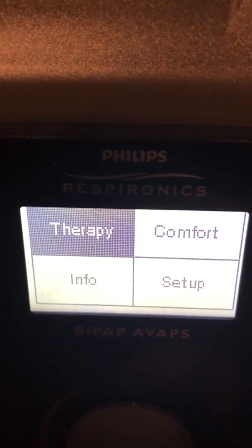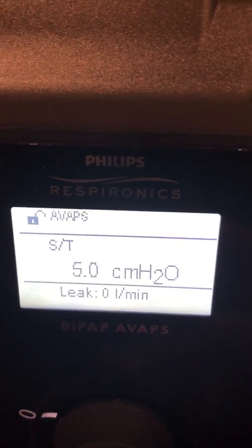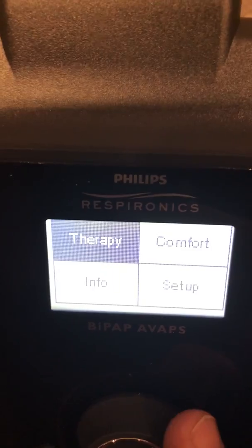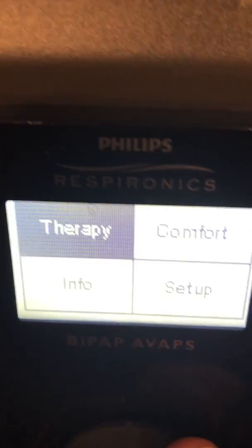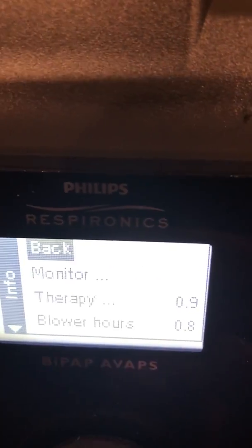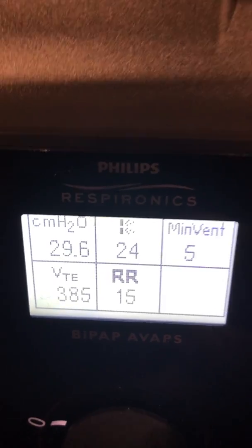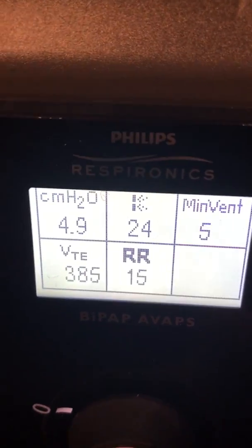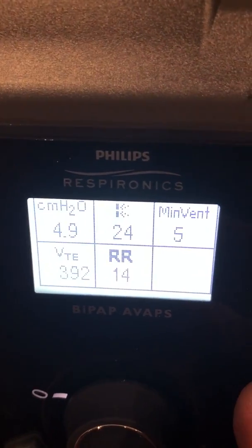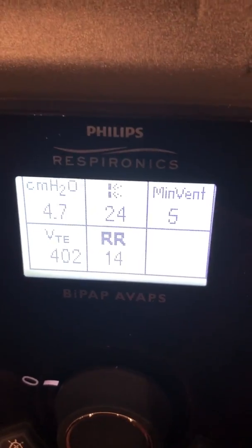Here we are at therapy — I'll select therapy, and at this point the machine will turn on. I'm going to hit the button one more time to get another option. For all of us clinical people who want to monitor certain parameters, I'm going to go down to info, select, and select monitor. Now we've got our airway pressure setting, our rate, minute ventilation, and tidal volume available to monitor in that window.